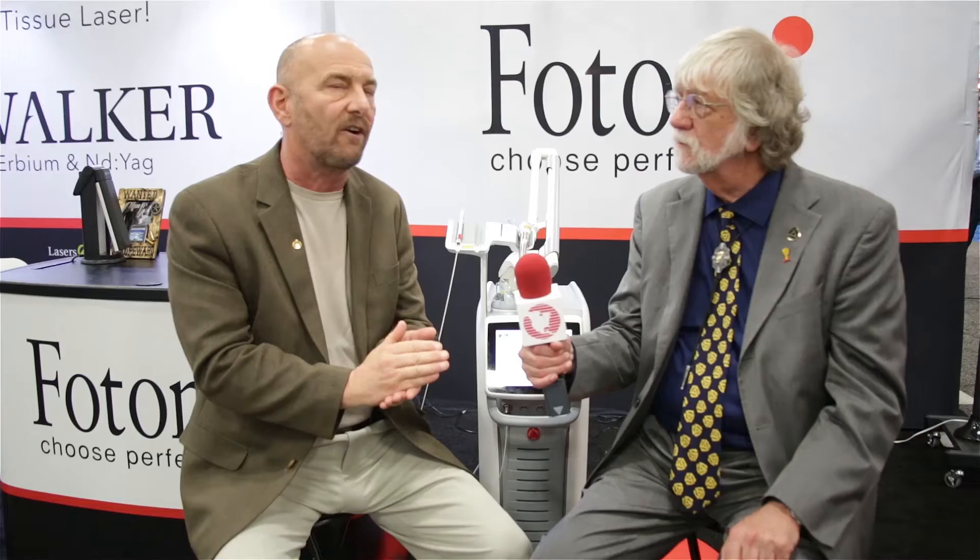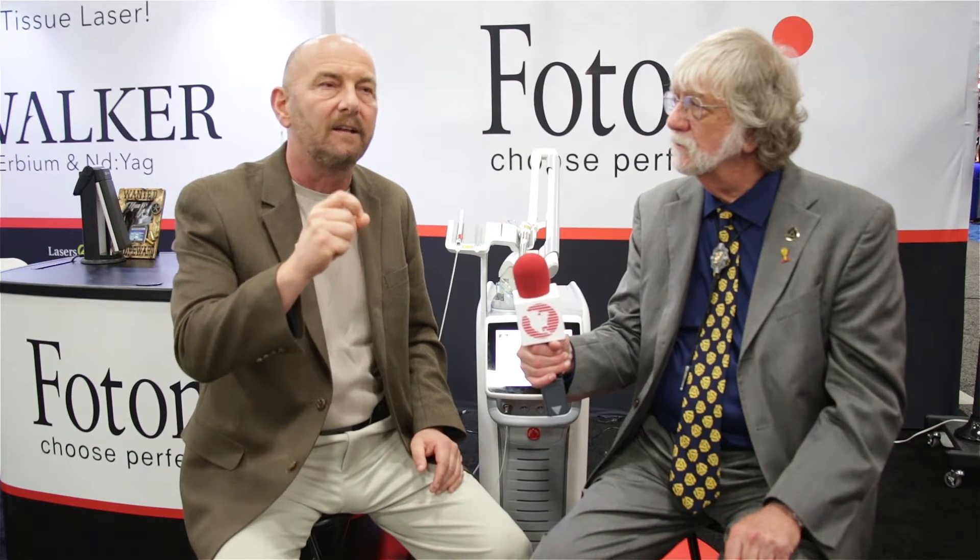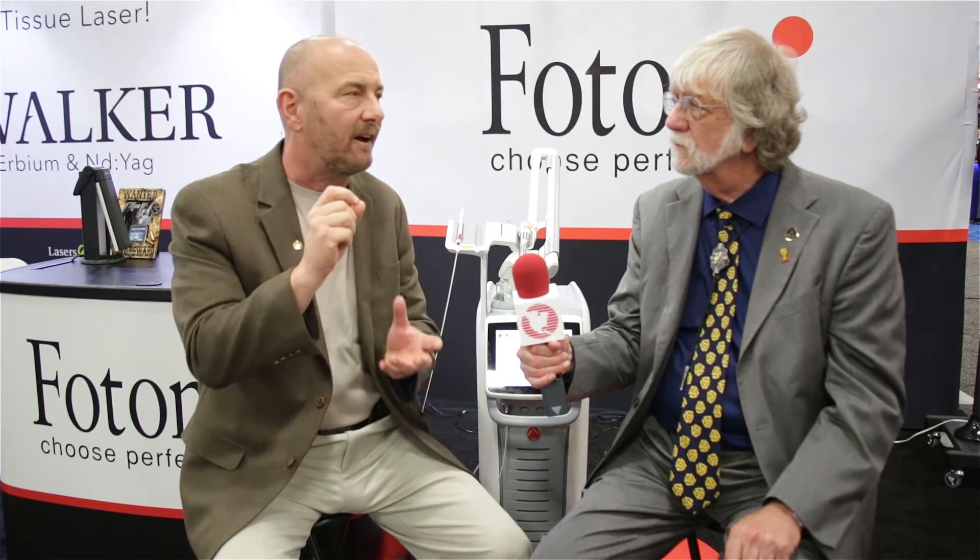The PIPS technology allows you to three-dimensionally clean these canals out and virtually sterilize those canals, so that when you fill it — when you obturate that particular root canal — you have a much higher success rate with your root canal.